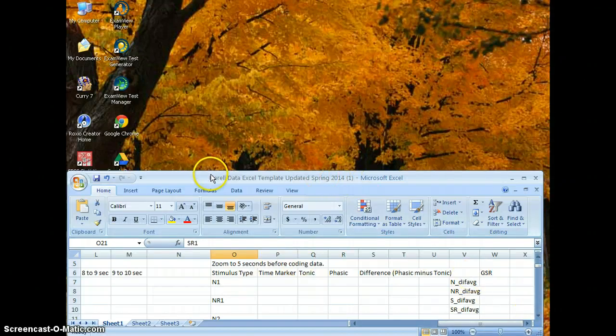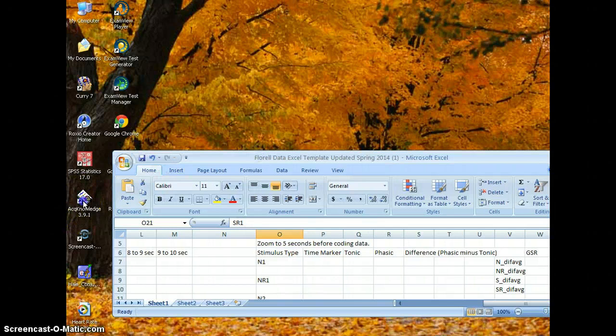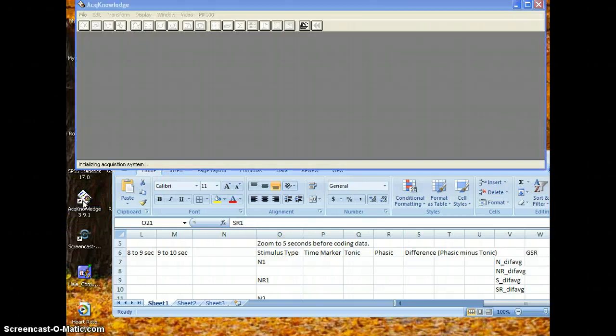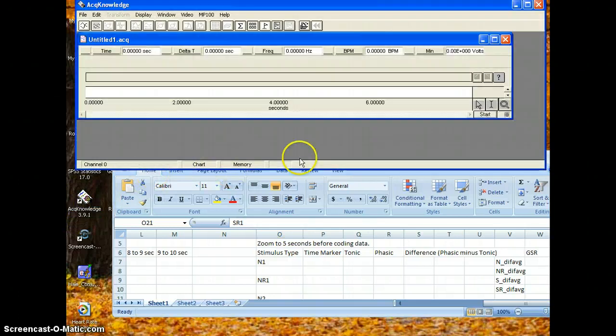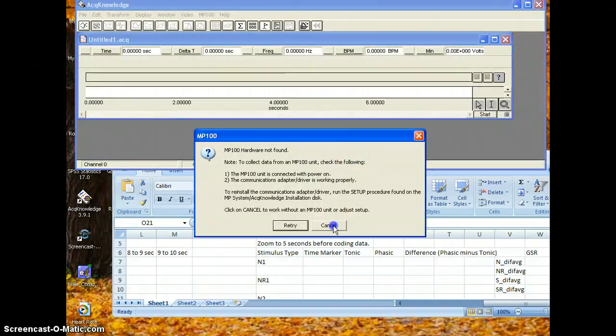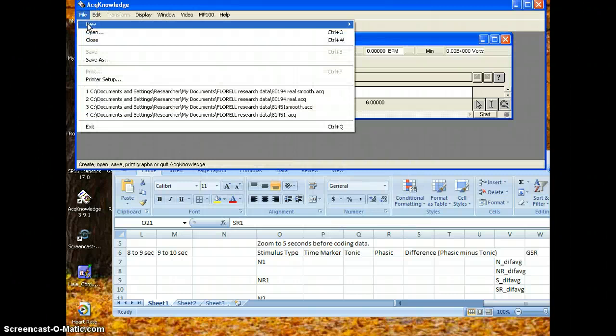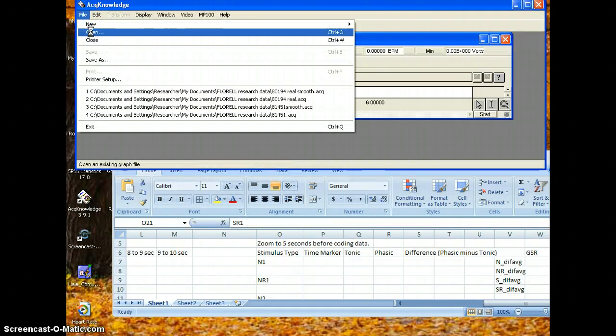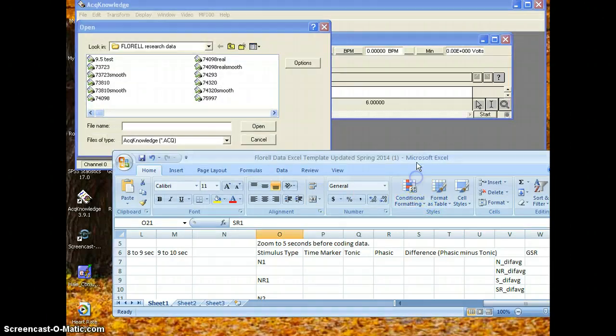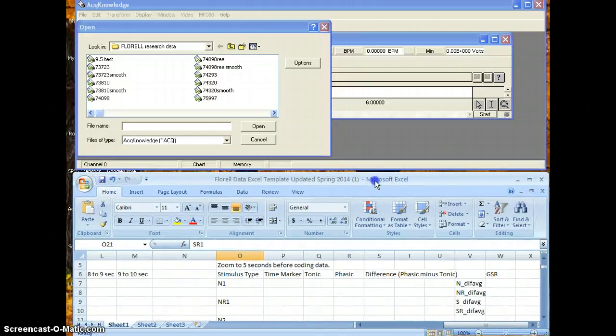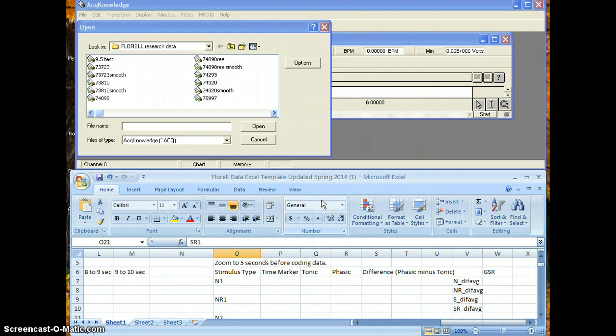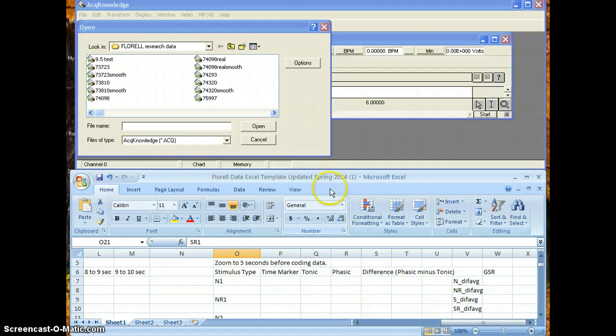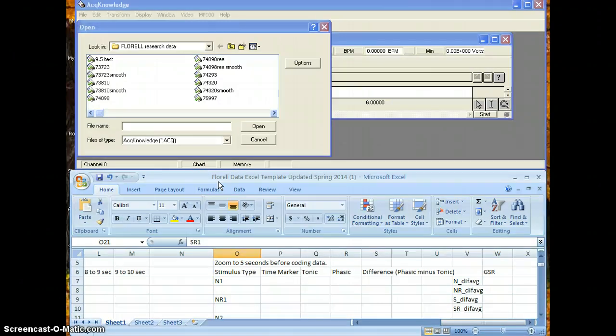So then we need to open the AcqKnowledge program and then click cancel. We need to go to File and Open. Now what's really important is that you make sure normally when you're really analyzing GSR, this will not be entitled Florell Data Excel Template Updated Spring 2014. This will be a participant number and it will say smooth.